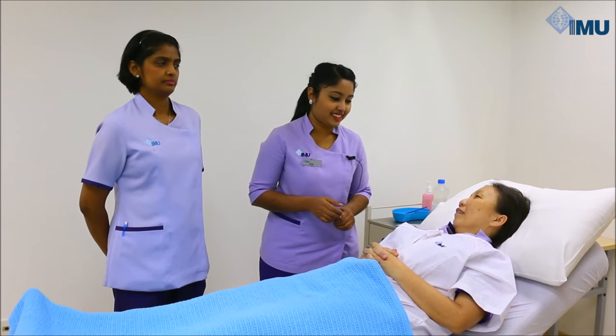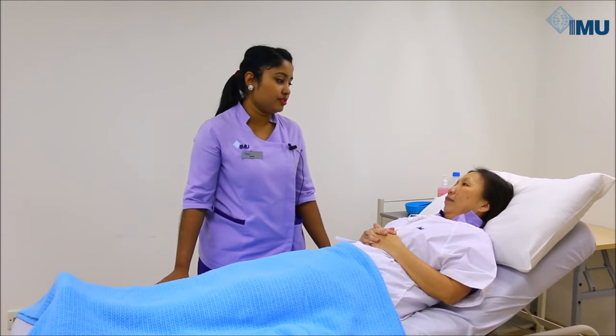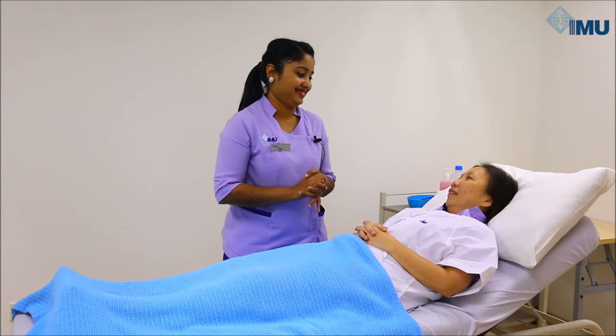Yes. Okay. Thank you. For me to perform this procedure, I will need you to remove your lower garment, including your panties. May I have your permission to proceed, please? Yes.